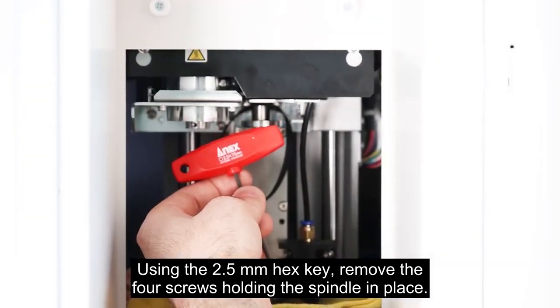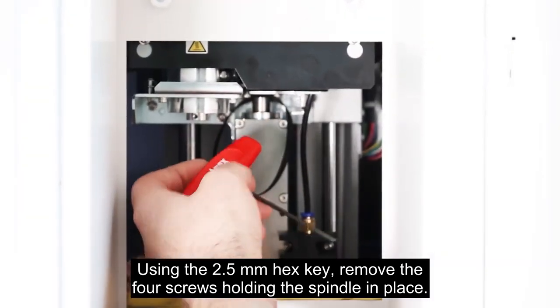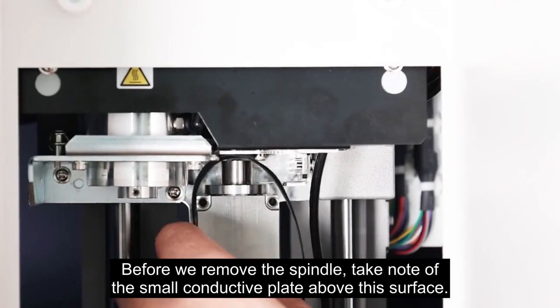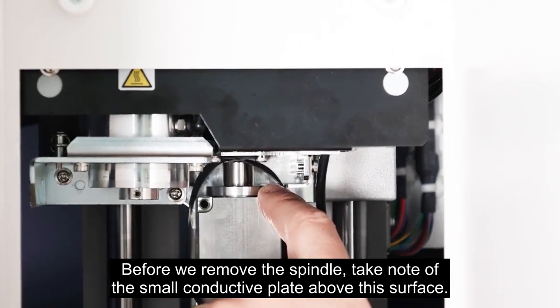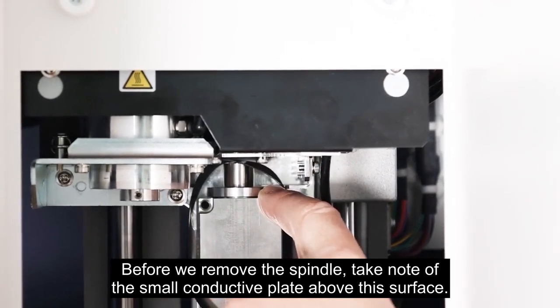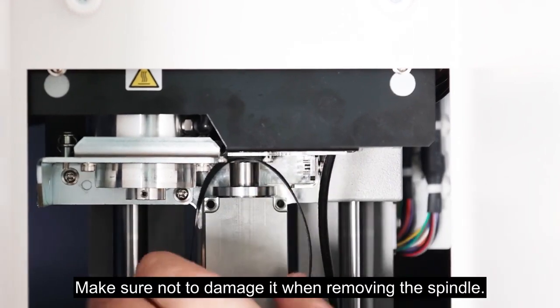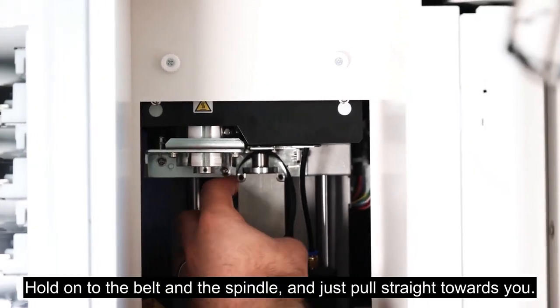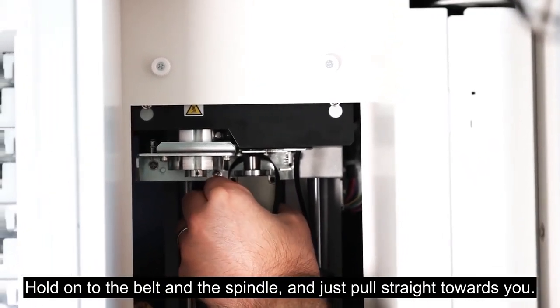Using the 2.5mm hex key, remove the 4 screws holding the spindle in place. Before we remove the spindle, take note of the small conductive plate above this surface. Make sure not to damage it when removing the spindle. Hold on to the belt and the spindle and just pull straight towards you.